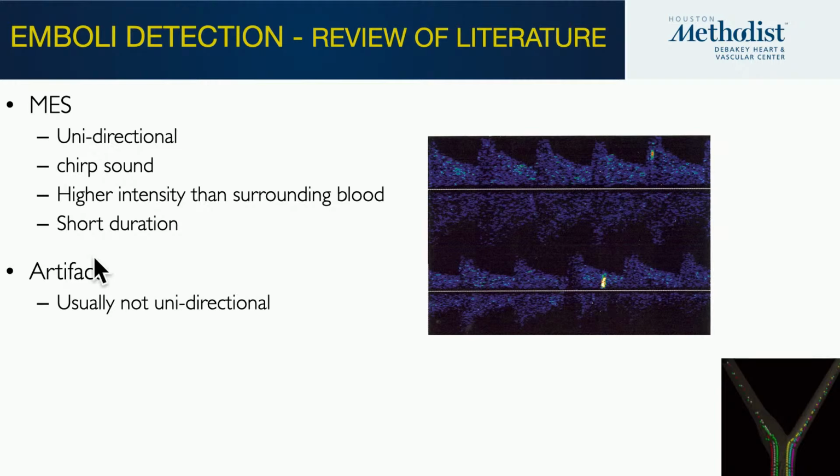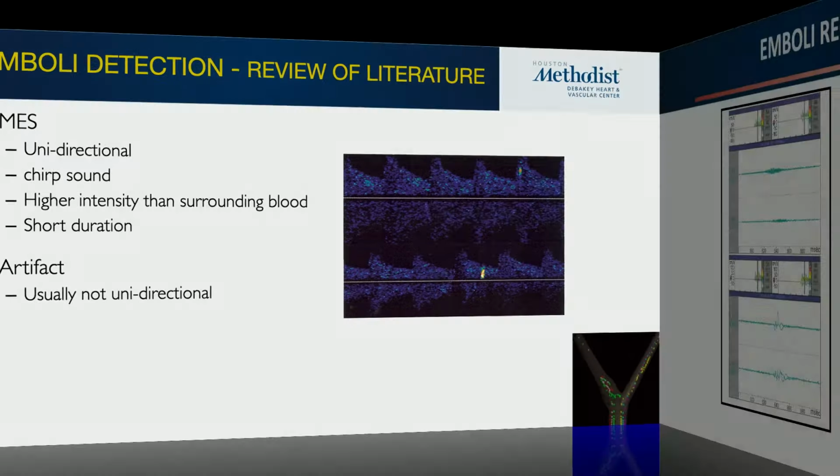And again, we want to differentiate those artifacts when you're just tapping, or there's a muscle movement that may generate some sound near the transducer.